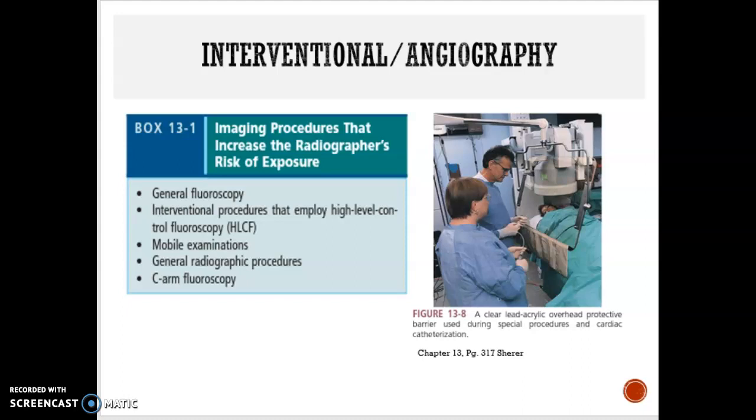For this reason, personnel must wear a lead apron instead of crowding behind a portable lead shield. The apron should be at least 0.5 millimeters lead equivalent to ensure adequate protection. Scheduling personnel to rotate through or spend less time in these higher radiation areas can decrease their exposure, and scheduling uses the cardinal principle of time as a means of additional radiation protection. Reduce the time, reduce the exposure.